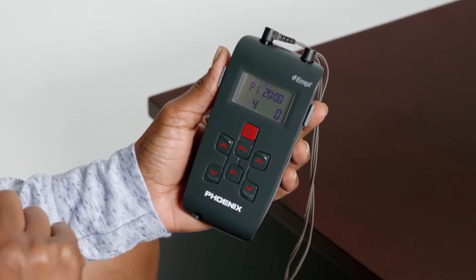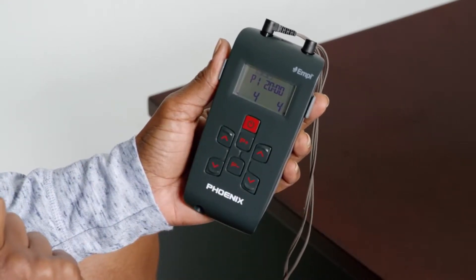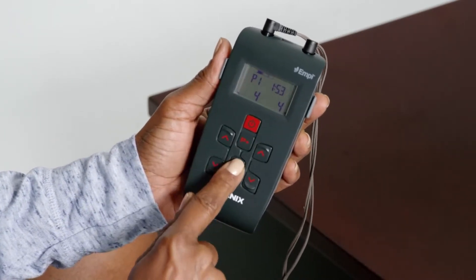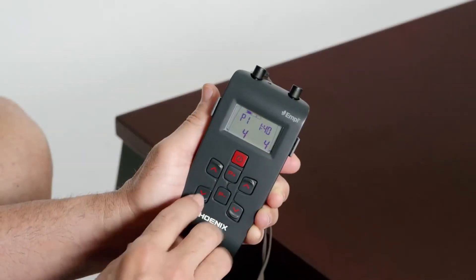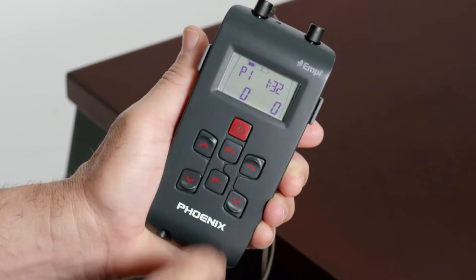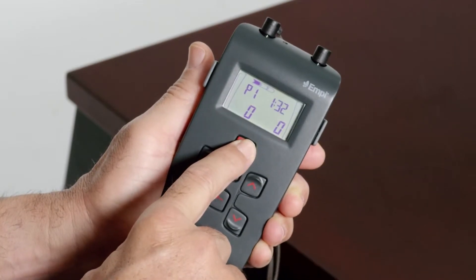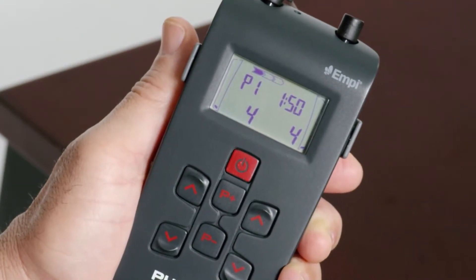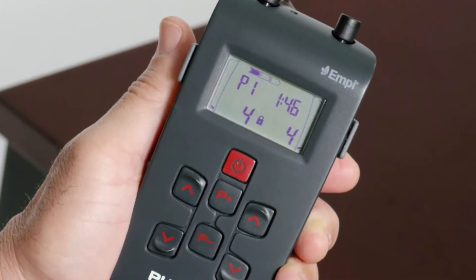When the device is set to the program prescribed to you by your healthcare provider, increase each channel's intensity by pressing the up arrow button to begin therapy. Once you increase the intensity on the device, you will not be able to change programs until you have decreased the intensity to zero again. To reduce the intensity, press the down arrow button. To pause therapy, quickly press the power button one time. To power the device down, press the power button again. As a safety measure, once you have left the intensity at a level for more than 10 seconds, the intensity will lock and cannot be increased. You will see a lock symbol appear on the screen when this feature is in effect.